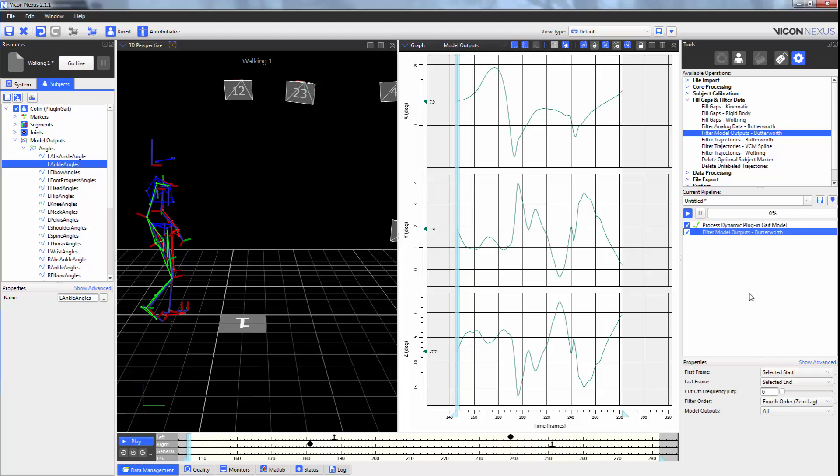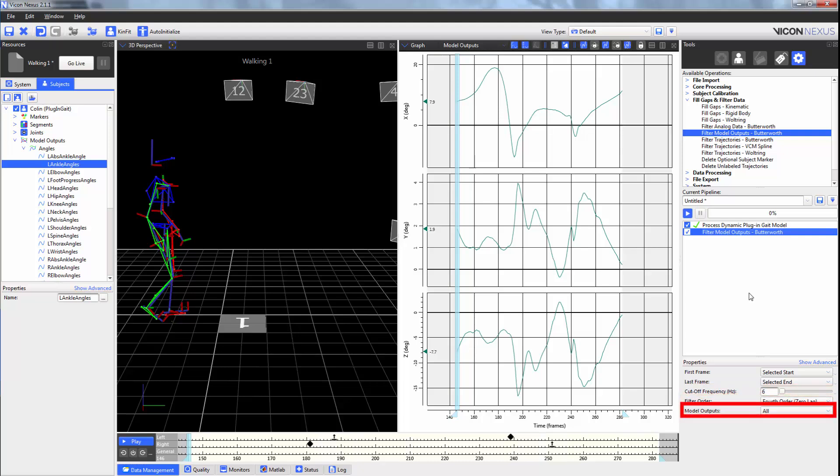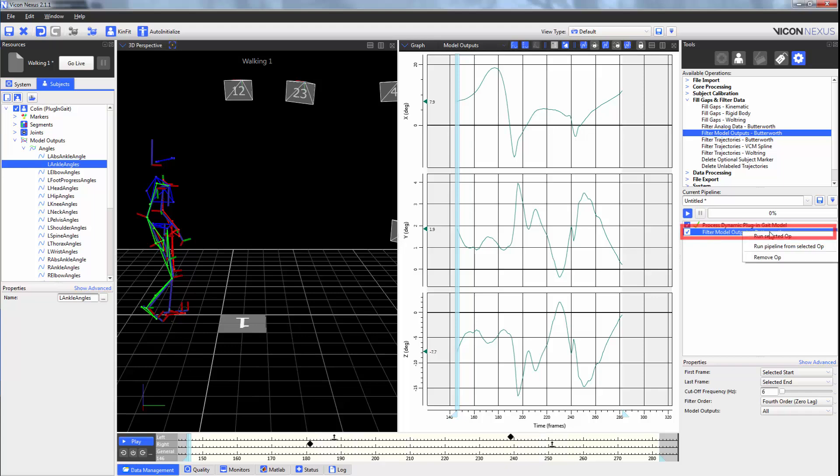Just like the Butterworth filter for analog data and the trajectories, you're able to select the first and last frame, the cutoff frequency, the filter order, and the model outputs. Running the Butterworth filter will smooth these model outputs.